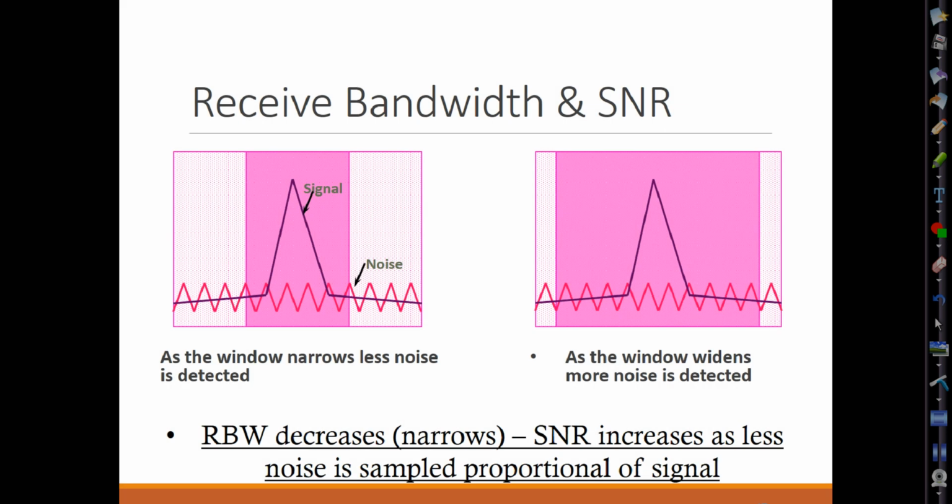This image, I think, shows it a little bit better. So you always have noise just gravitating towards the bottom of that signal amplitude and more on the periphery. Remember, we want to sample our signal at peak amplitude, at TE, right? And that's usually right in the middle because you rephase the signal and then it dephases again. So it's very symmetrical. So let's filter out the beginning of that rephasing of that signal, and then filter out the edge of the dephasing of that signal. Our signal never really changed because we keep the same good signal that we want, but we're just filtering out the noise.